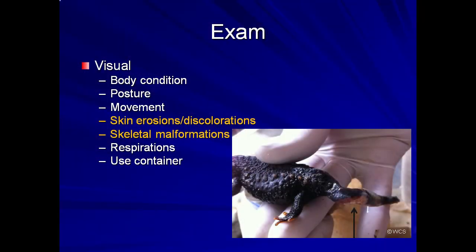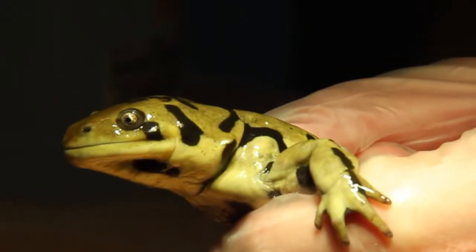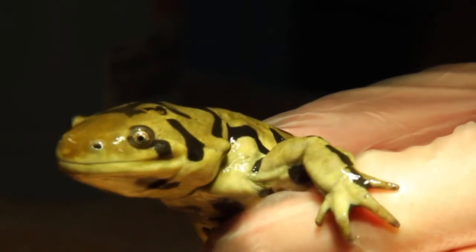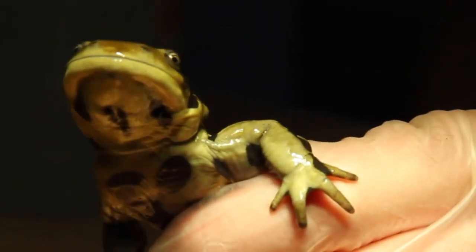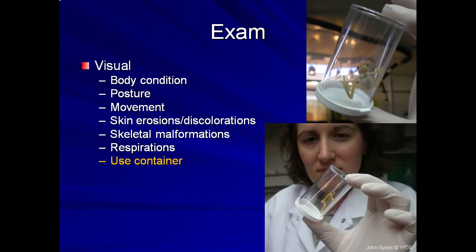Skin erosions, discolorations, and skeletal malformations can generally be easily observed. The rate and depth of respiration should be observed before the animal is stressed by handling. For example, normal gular respirations can be observed in this video, though the rate may be increased as the animal is already being handled. A container can be very useful for doing an exam without handling — all of the above parameters can be observed while the animal is restrained in a clear tube. Animals can also be easily weighed with small plastic containers.